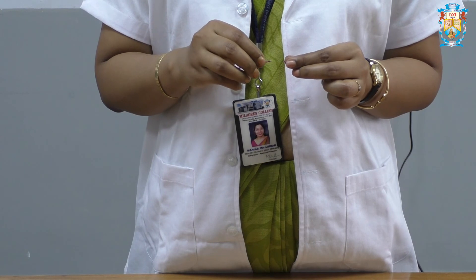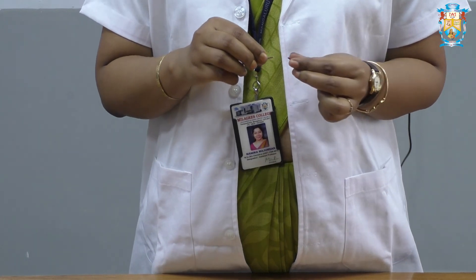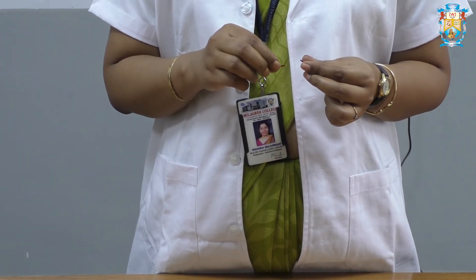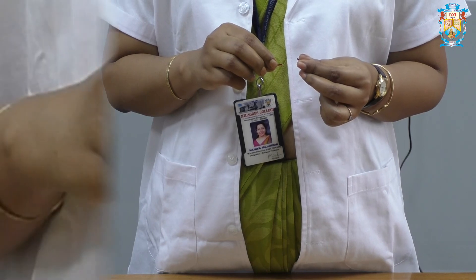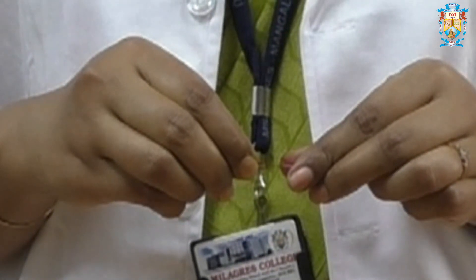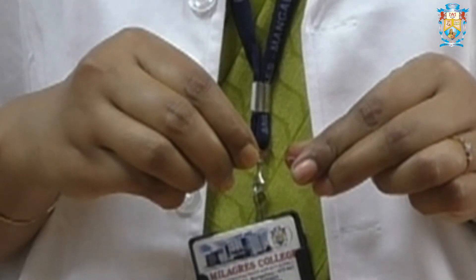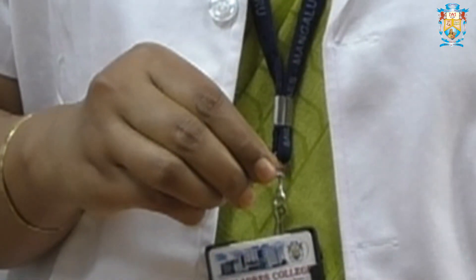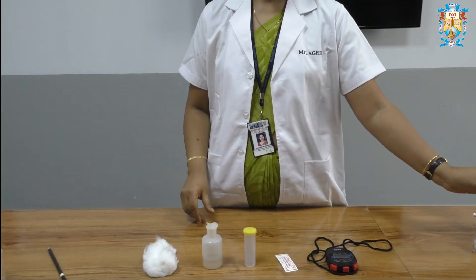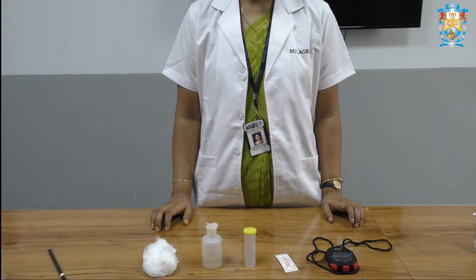Look for the appearance of fibrin thread between broken ends. As there is no fibrin thread, we will again break the capillary tube after 30 seconds. As you can see, there is an appearance of fibrin thread at both ends of the capillary. Note the time. The normal range of clotting time by capillary tube method ranges from 3 to 6 minutes.